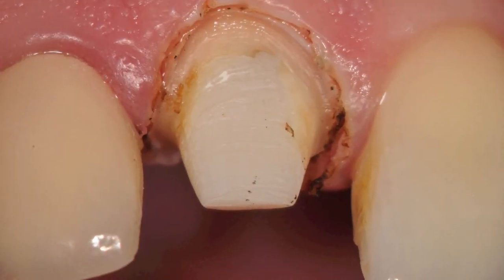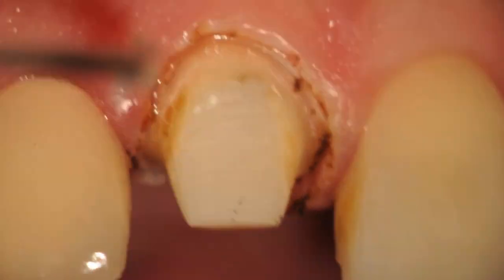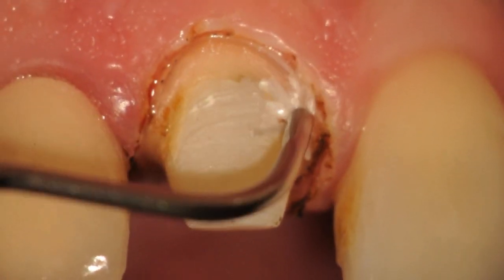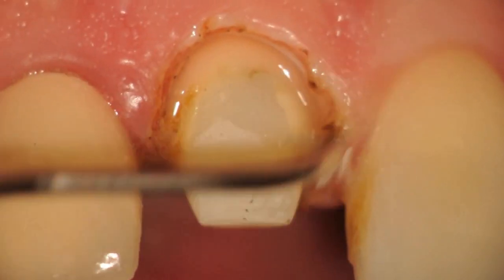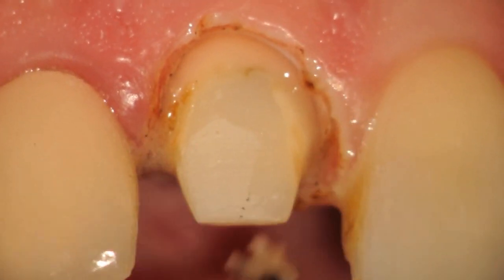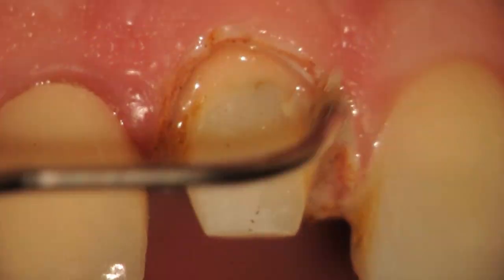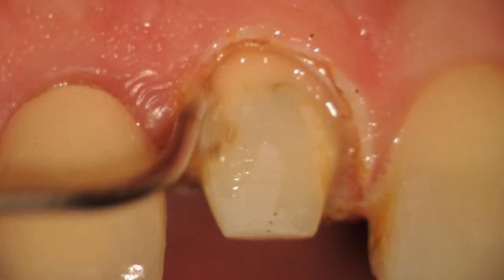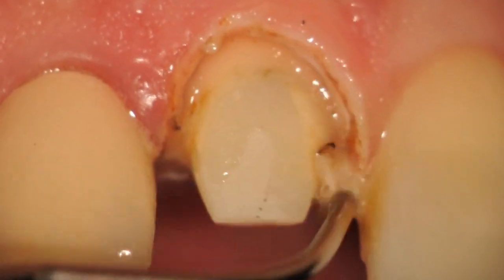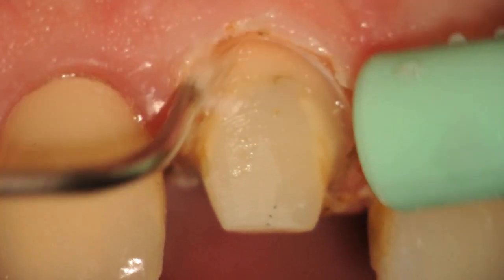Immediately post-operatively there is charring. What we do is use hydrogen peroxide and an ultra-dense syringe brush to remove any of the organic debris or charring on the tissue. The hydrogen peroxide is scrubbed gently into the tissue with short back-and-forth motions, and you can see that loose debris and some white necrotic slough that has occurred in the tissue is removed.